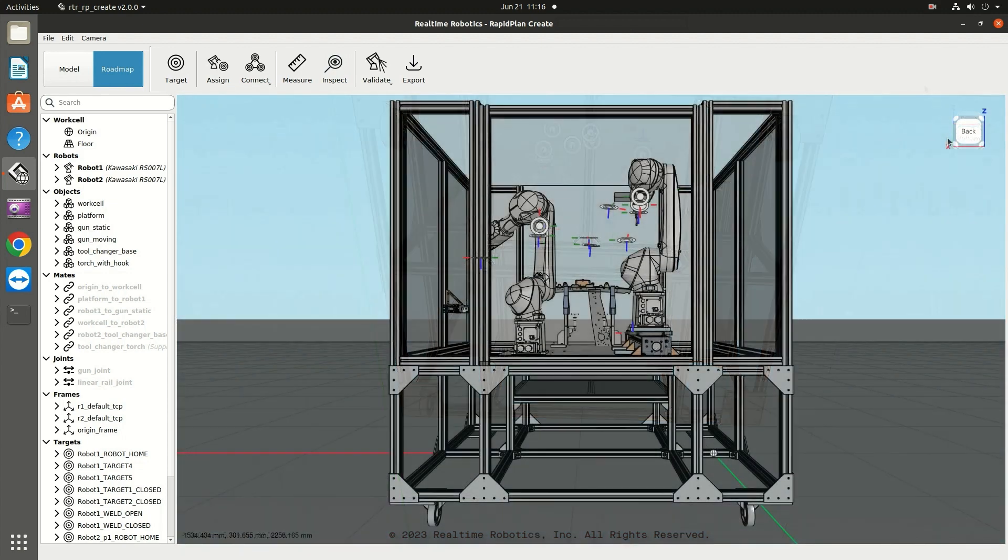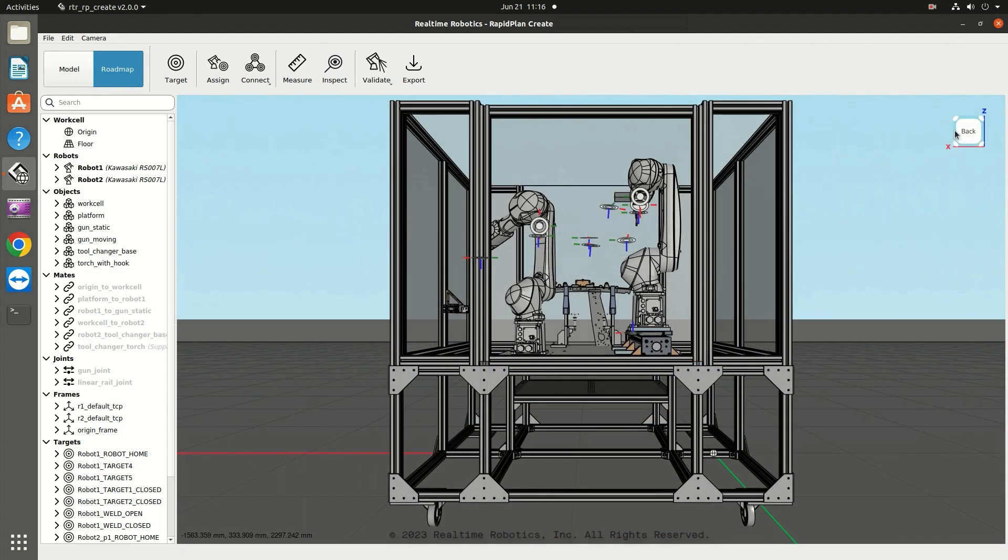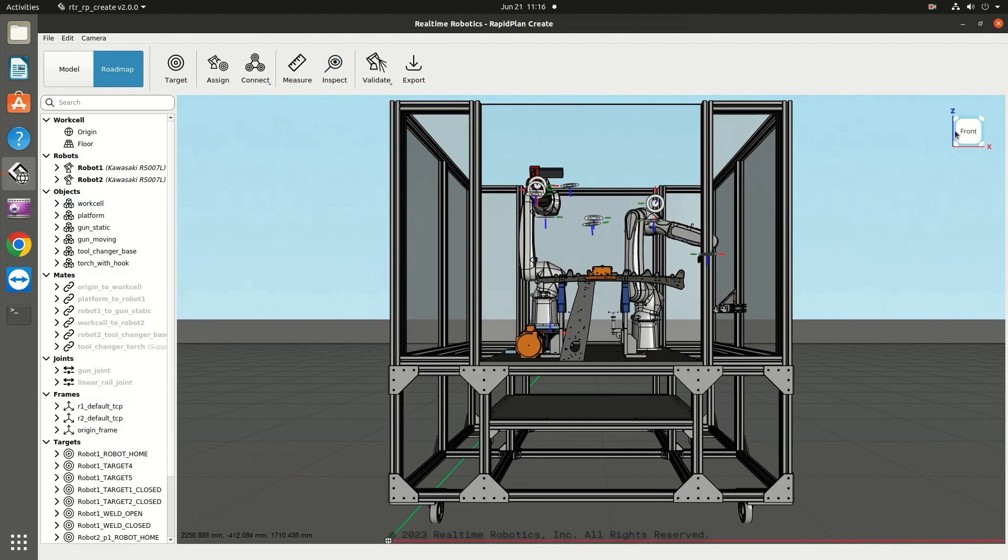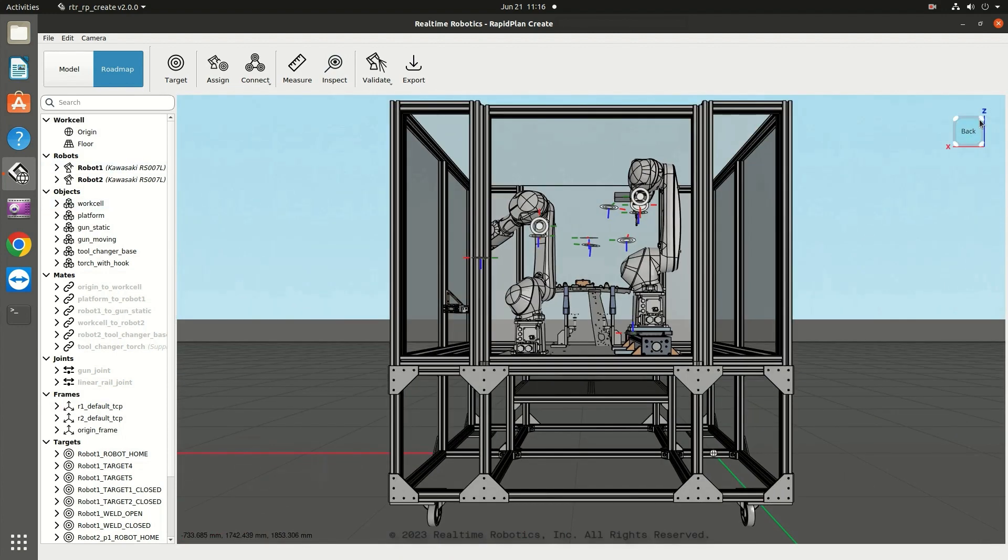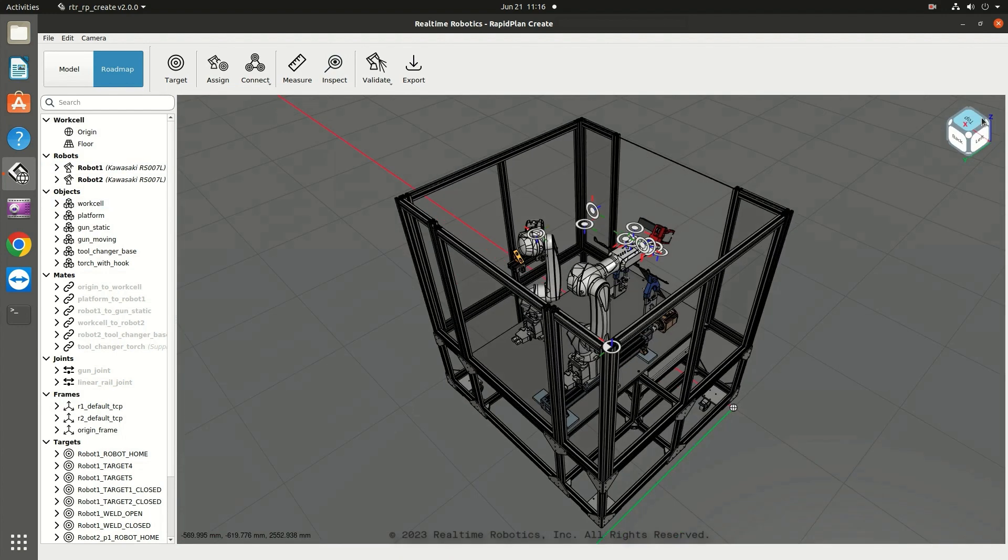To switch to the opposite of the current view, click anywhere on the border of the cube. For isometric views of the work cell, click on the corners of the cube.